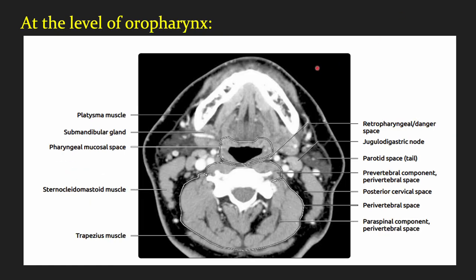This is the axial section taken at the level of the oropharynx. In the center we have the pharyngeal mucosal space. Posteriorly we have the perivertebral space, and in between these two spaces we have the retropharyngeal and the danger space. Laterally we have the posterior cervical space between the sternocleidomastoid and the perivertebral space. Here we can appreciate the parotid space consisting of parotid tissue, which continues from the suprahyoid to the infrahyoid.